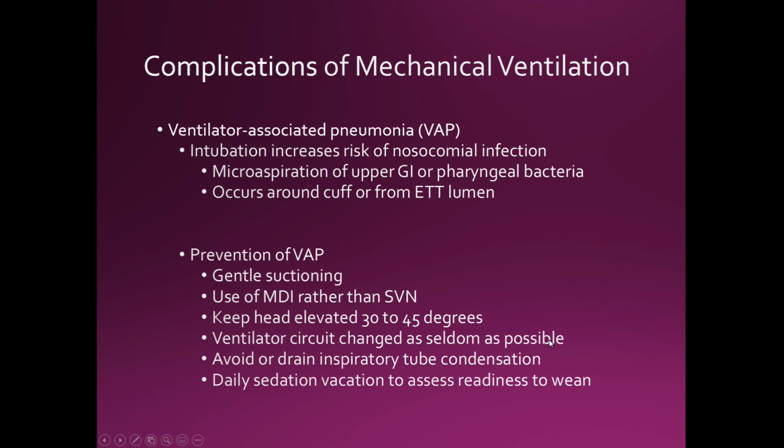We don't want to break the circuit because remember, our respiratory system is a sterile system. Anytime you do some suctioning, nasotracheal primarily, it is going to be used with sterile gloves. A lot of RTs do not use sterile gloves because they just want to suction and leave. That's a no-no. Please don't be that type of therapist.